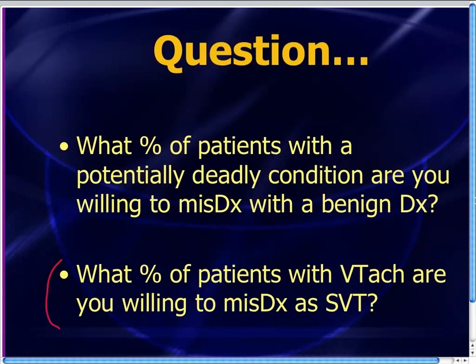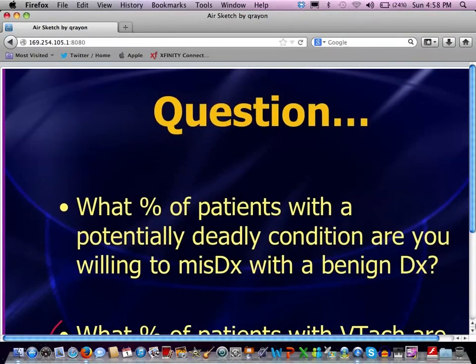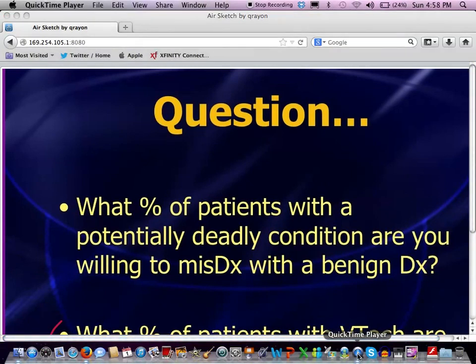So again, I will say it again. Be very careful about using adenosine as a diagnostic maneuver, because 5 or 10% of your VTAC patients will convert with adenosine. Take a look at the EP literature. And, well, don't make any conclusions just because they convert. Those patients still need a really, really thorough workup and scrutiny of that EKG, and maybe all the way through the EP test.